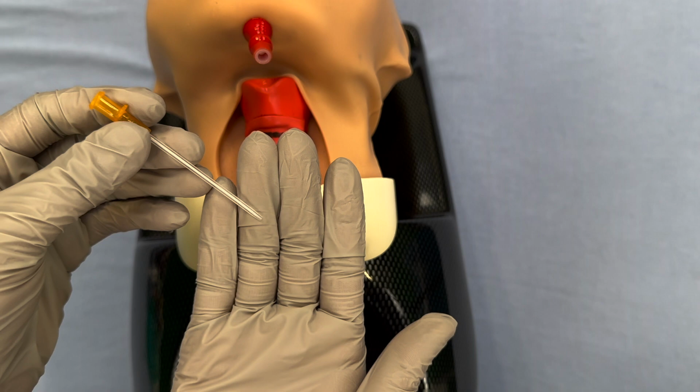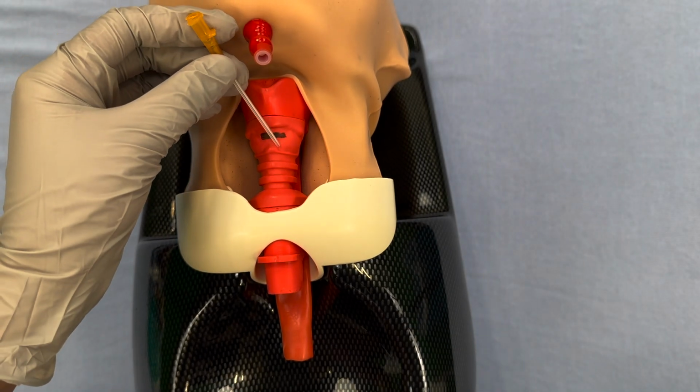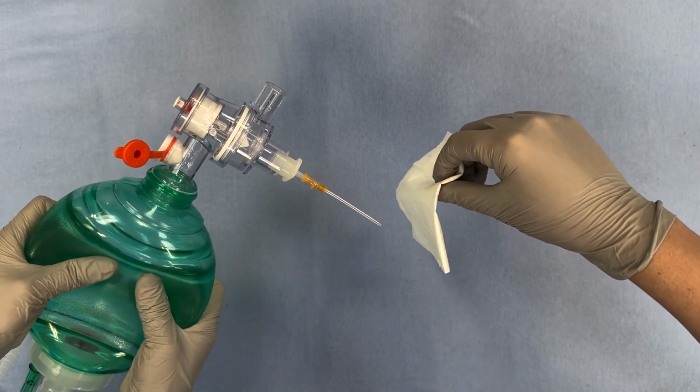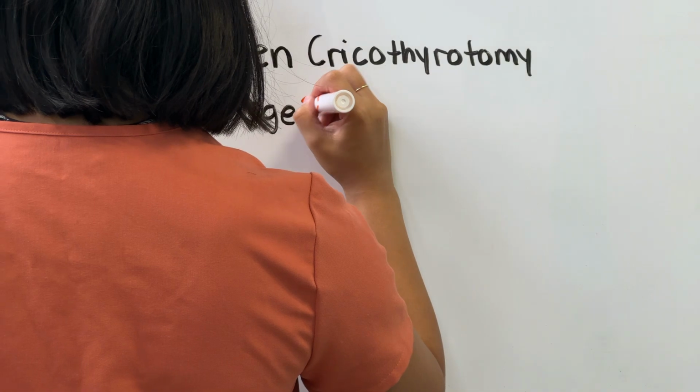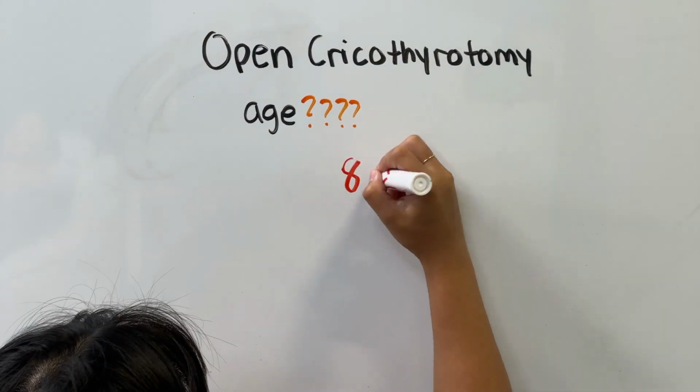We're going to use a 14-gauge catheter, which is much smaller than the smallest ET tube, but it's big as far as IVs go, so it still has just a little bit of space to oxygenate and ventilate temporarily. The age at which you can do an open cricothyrotomy in kids is debated, and it depends on the patient. It's somewhere between 8 and 12 years old.